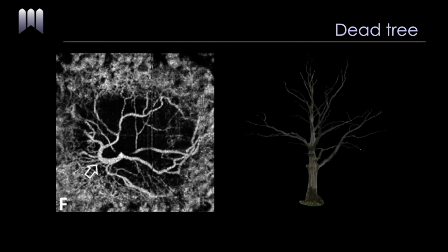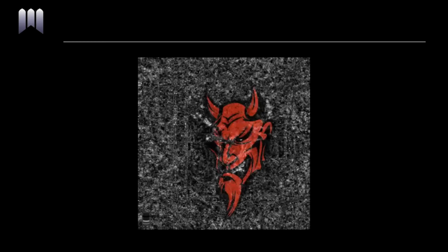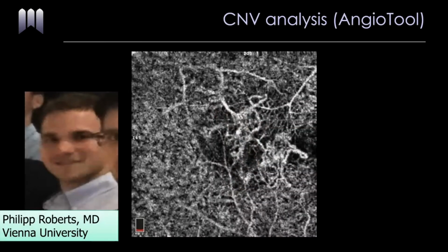In our hands, when we got our OCTA, we started to see these lesions, and we wanted to extract these features that the Souied group talked about. But unlike these very creative, positive features that they were able to extract, every time I looked at a lesion, I only saw very negative appearances. So it wasn't really going to work for us.